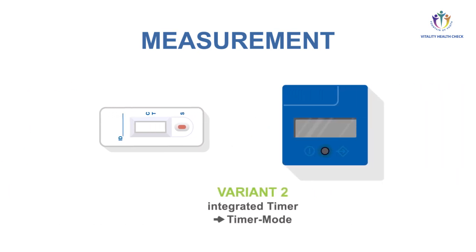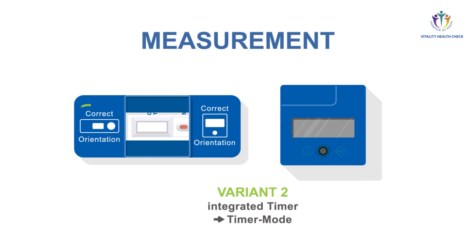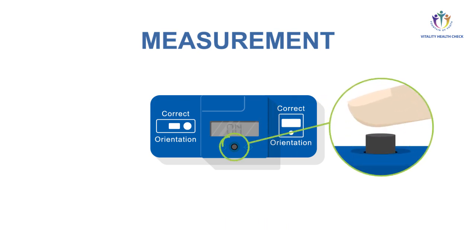For variant two, timer mode of the VHC reader, place the adapter over the test cassette. Control for correct alignment according to the pictograms. Place the VHC reader in the right direction on top of the adapter. Turn it on by pressing the button shortly. After a self-test, the VHC reader shows on.